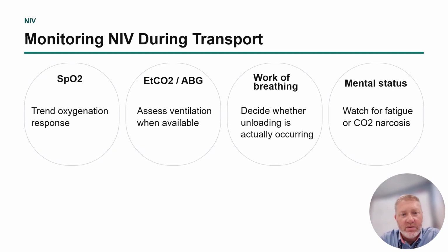In terms of monitoring non-invasive ventilation during transport, you'll have a few things at your disposal. So SpO2 from the pulse ox, trending their oxygen response, and knowing that their oxygenation is directly related to the FiO2 that is being delivered, as well as the PEEP, so that EPAP level.